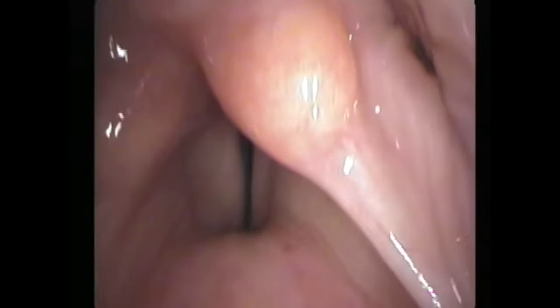Let's review a case where the left lateral cricoarytenoid muscle weakness is subtle. The true vocal cords come all the way together, and if you focus on them, it will seem like everything's normal. To a degree it is - the thyroarytenoid muscles are fairly equivalent. So if you can get the vocal processes to come together, whether they rotate or slide together, you'll have a relatively normal voice, except it's weaker than normal because you can't tightly close it. And in this case, to see the subtle weakness, we're going to slow the video down.